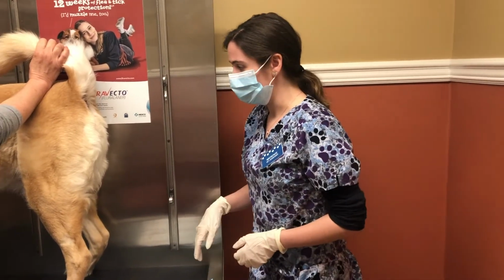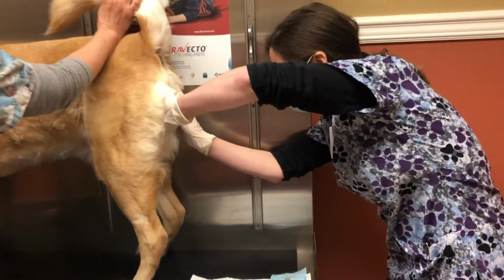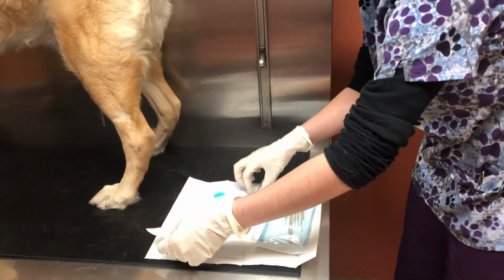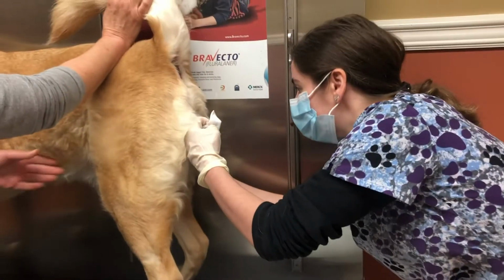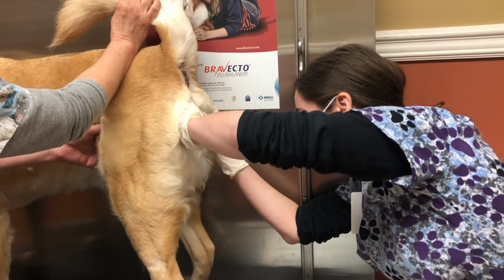So the first thing I'm going to do is I'm going to have someone hold the tail out of the way, and I'm going to clean the vulva with my chlorhexidine and my sterile saline. And we're just going to mostly get all this hair out of the way.